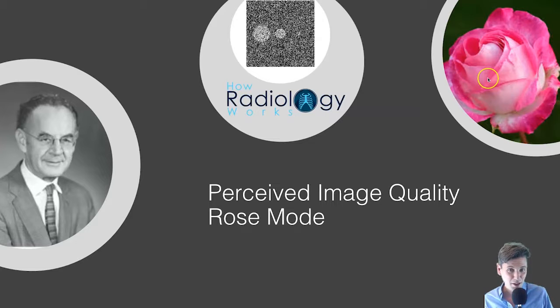But what we talked about today is the Rose model, and the Rose model says that for an ideal case, it's the contrast and it's the size, namely the square root of the area, or for instance, if it's a circle, it will scale linearly with the radius in terms of our ability to visualize objects. Again, these are very simple scenarios of a uniform object in a uniform background.